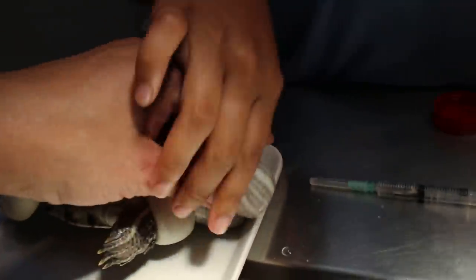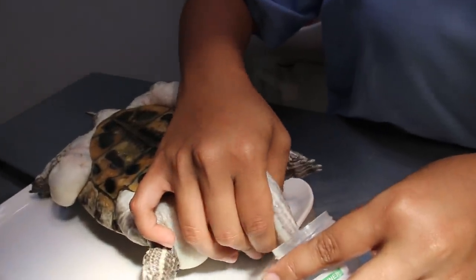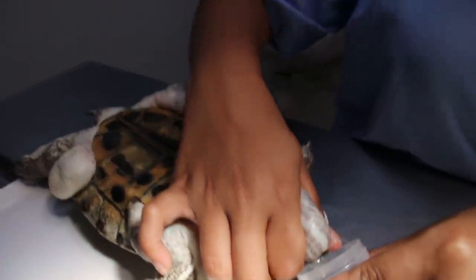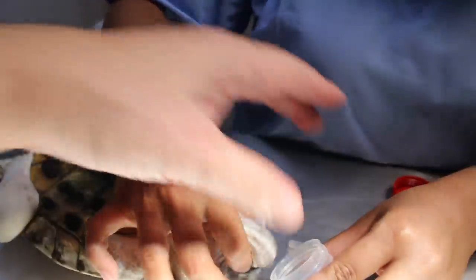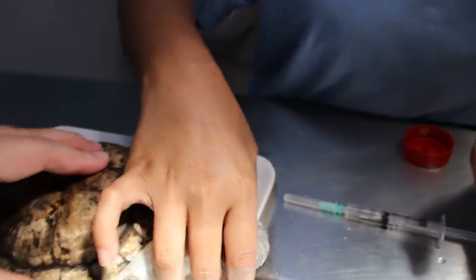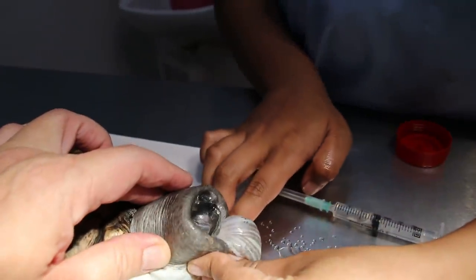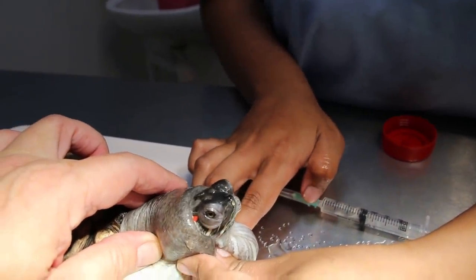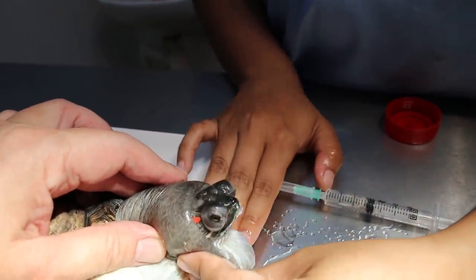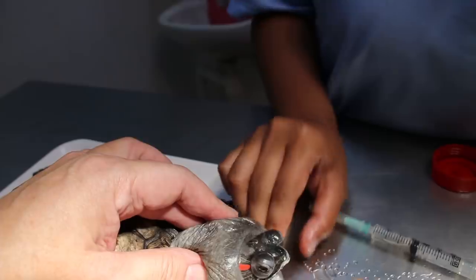Pre-collect the fluid. Not too long. No more already? It can't breathe here. Let it express out — it might bite you though. Some more, express out. We try not to cut. If we cut, of course it comes out faster. One centimeter, but better not.